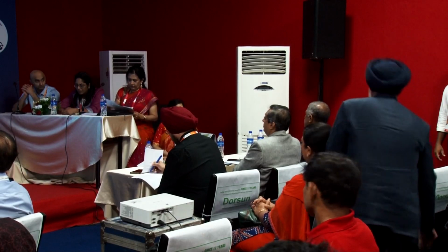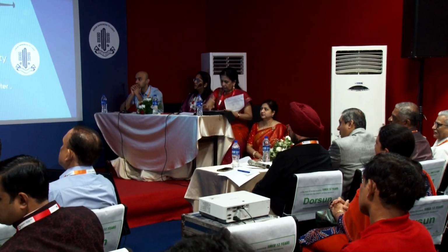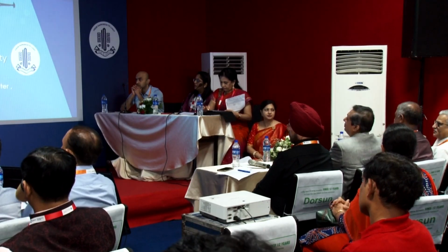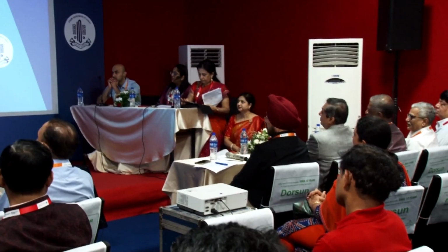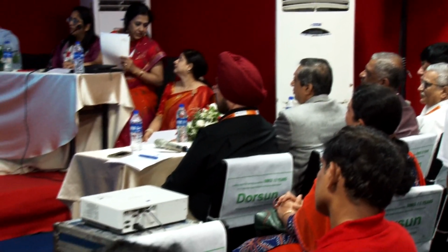Yes, sir. Okay. And second thing, how much is the grip in these lenses? Because I've seen the surface is very smooth. Yes, sir. We are giving it a grippy surface, like your cricket bat grip. Okay. But so far, as you have shown, it is a very smooth surface. Yes, sir. This is the prototype. I'm working with Orolab now. We have gone to the third prototype now. So soon we'll be printing it in silicone with a proper grip, and we'll also be doing a drop test. Like when new phones come out, they do a drop test to see how the case is protecting. So we are acquiring more lenses to do a drop test to see how it withstands the shock. Okay, thank you. Thank you, sir.